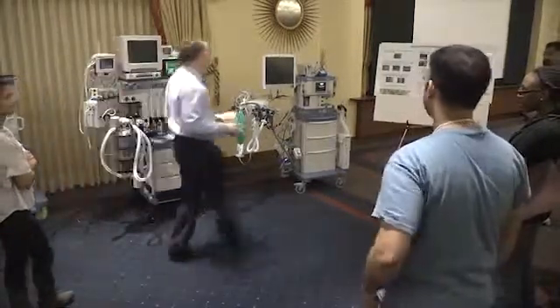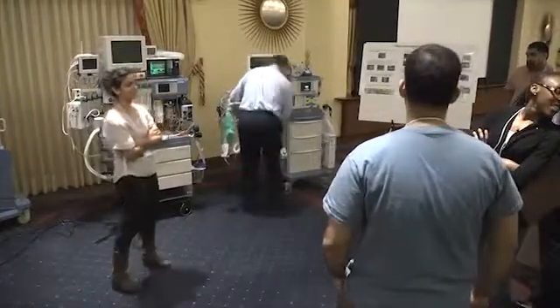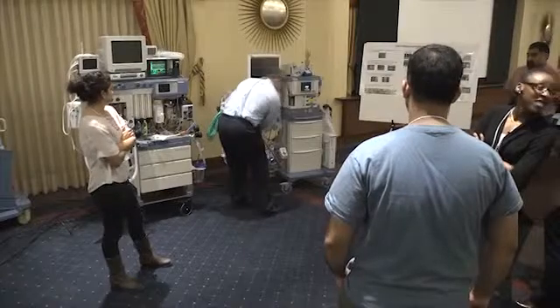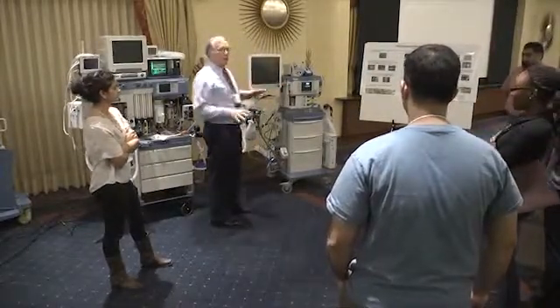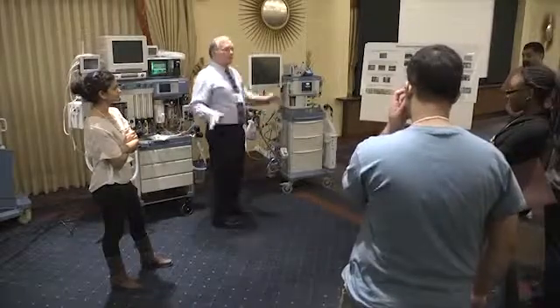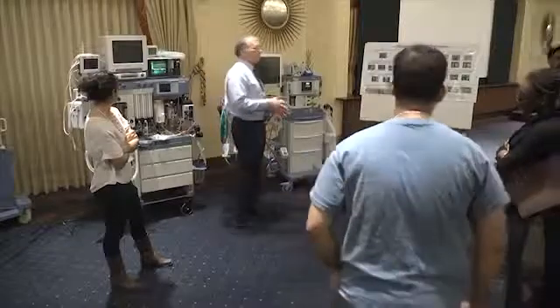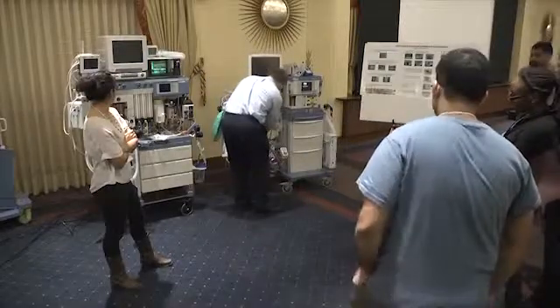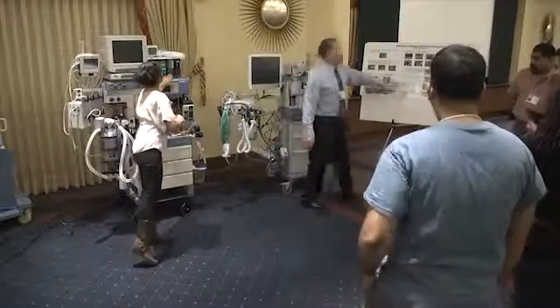There's your CO2 yellow for today. And this guy screws off. So if he's loose like that, it'll leak. So there's really no guarantees of anything. That's why you're doing these pre-use checks, because all little things could happen over time or during the time that it's actually happening. Okay, so that's our CO2 absorbent.